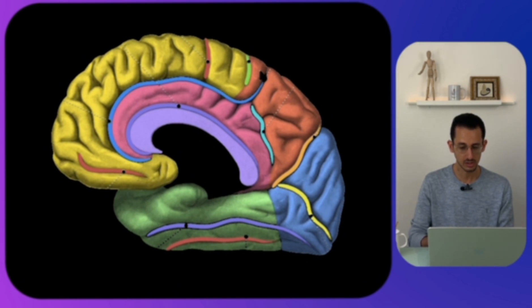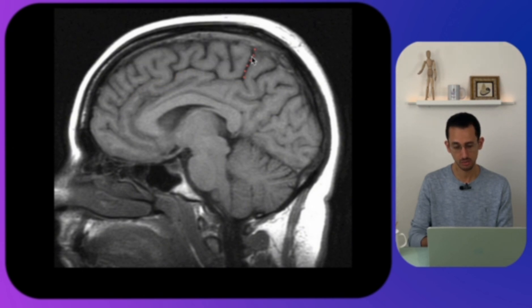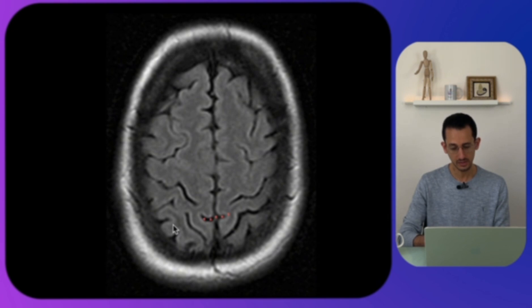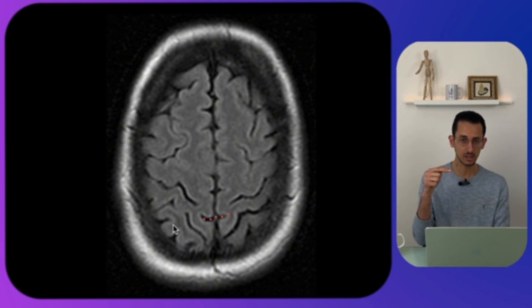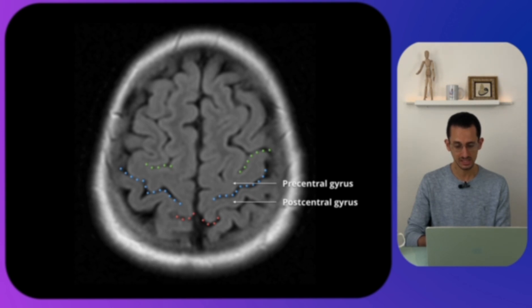Looking at this MRI scan, this is the cingulate sulcus going all the way up to form the marginal sulcus. The marginal sulcus separates the paracentral lobule from the precuneus posteriorly. On MRI imaging, higher up you will find that this sulcus appears as the only one forming a connected line between the two hemispheres. Once you identify it, the first sulcus in front of it is the central sulcus, then posteriorly the postcentral gyrus, and anteriorly the precentral gyrus — making it easy to identify the motor cortex.